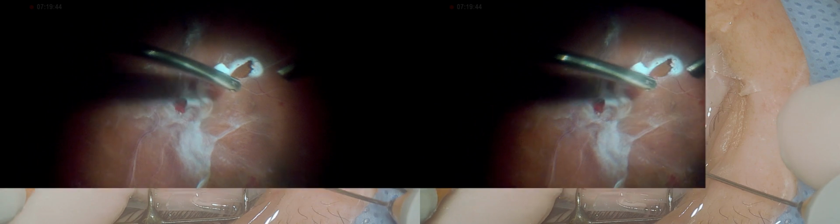The band was cut precisely, deep enough not to reach retina, and adhered hyaloid was then removed accordingly. A 25 gauge ILM forceps is used here to lift up the membrane, grab the tissue and dislodge it from the retina adherences. Epiretinal tissue is stored away as a great cleavage plane is reached, allowing it to be separated beautifully as a layer.